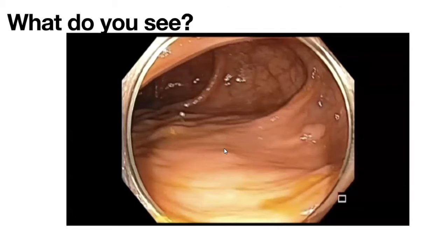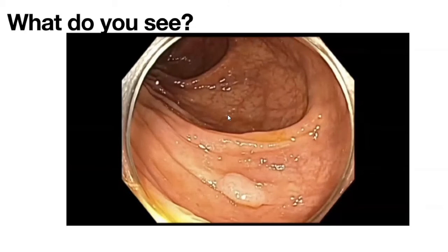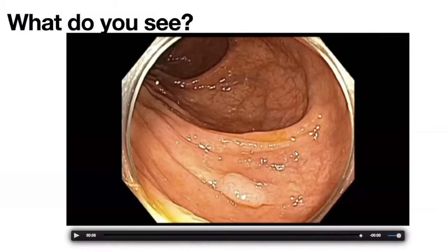So we did this colonoscopy, and this is as I was coming up the ascending colon into the hepatic flexure. This is what I see. Maybe one of you could actually talk about it. Actually, Sriram is also here. Maybe Sriram can comment. Sriram? Joined late, no mic, he said. Okay, all right. Maybe Norio wants to comment on this.